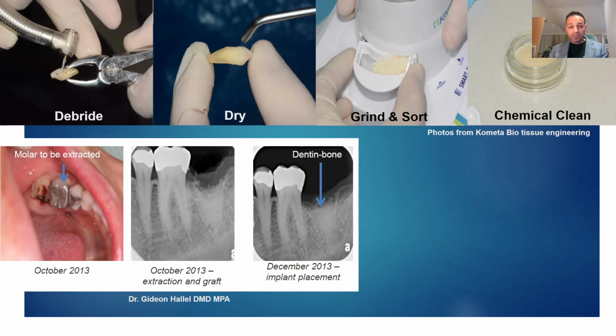Obviously, one of the reasons why it's potentially not taken up very much is the risk of introducing caries or bacteria into the bone graft site, as well as the fact that there's a large process to make it, and obviously we know that time is money, and we need to try and reduce that surgery time as much as possible.